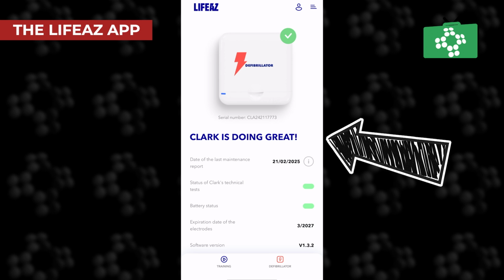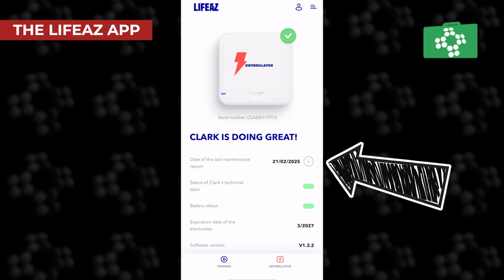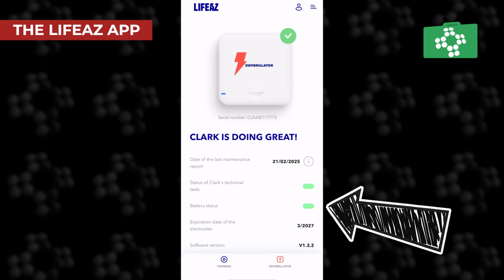The next line on there is the date of the last maintenance report. In this instance, it's 21st of February 2025. This pretty much repeats every 7 days, and the unit is sending a signal to the cloud, and that sends it back through to the app. The next line is about the status of the technical tests, and again, there's a little green icon there which shows it's good. Battery status, again, this is a brand new unit, so it's showing full.